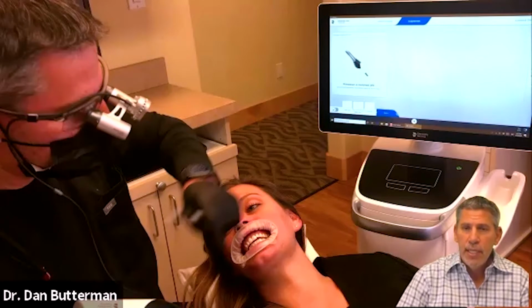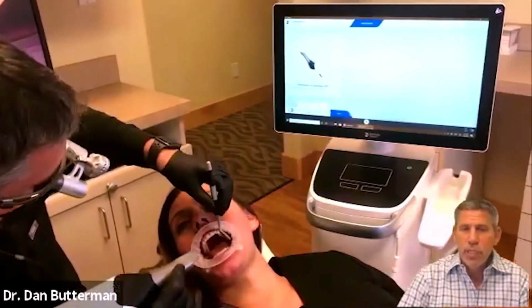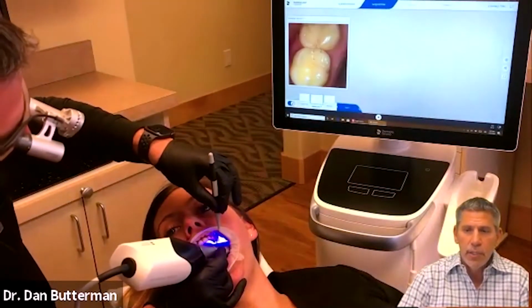So just taking a look at real-time scanning, for those of you that haven't seen scanning happen with a Primescan, this is just my typical workflow. Now, this is with teeth, and you'll see in a minute with implants. I'm going to image the upper arch, and you'll see approximately how long it takes. All this is in real time.